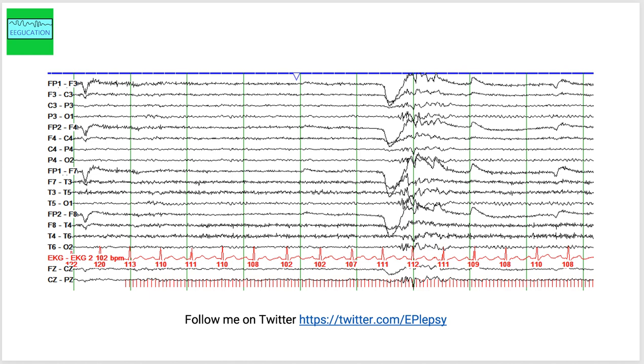In approximately 15% of patients with generalized epilepsies and approximately 2% of individuals with focal onset seizures, you can see photosensitive changes on the EEG.